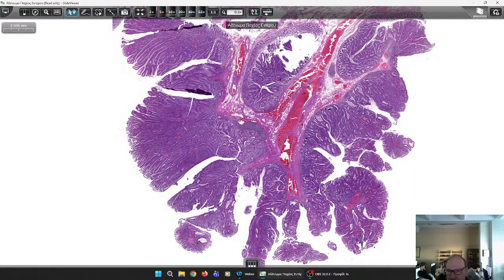the case here, because we have a pedunculated adenoma. That means an exophytic adenoma with a stalk. What is the stalk? The stalk is the submucosa following the exophytic compartment of the adenoma. If you see true invasion within the stalk, the submucosa, then you think that colectomy should be performed.